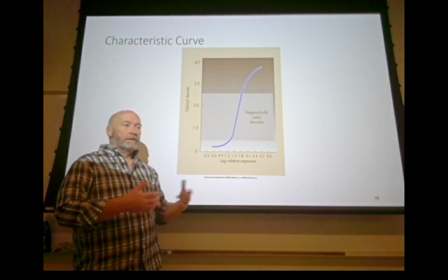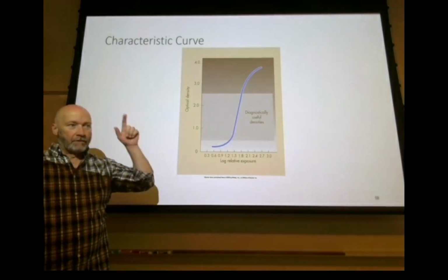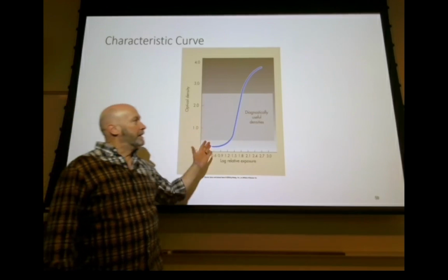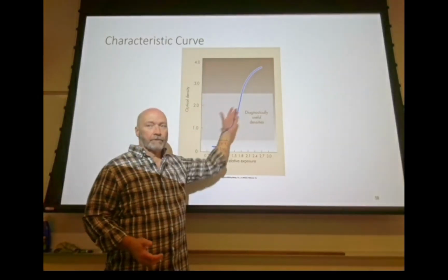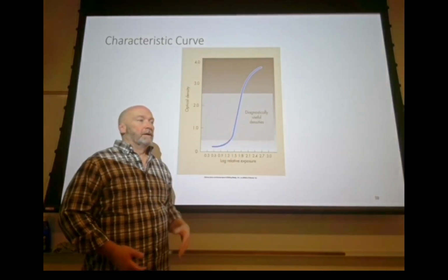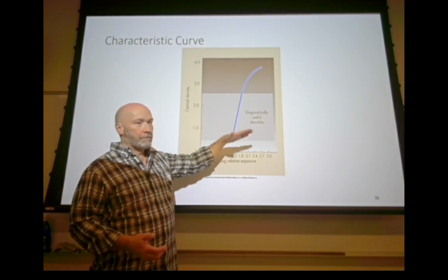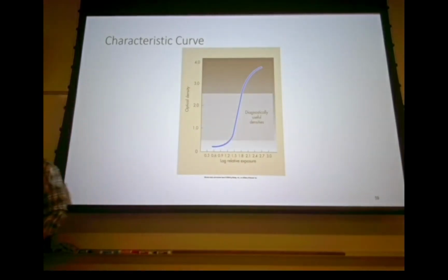So when you're looking at your computer algorithms with all those little lines that are going up and down, and it has one of these assigned to it, anything that you want to see with very high contrast is going to have a very vertical straight line portion of the curve representing that histogram lookup table. And if it's horizontal, then that's going to represent lower contrast.